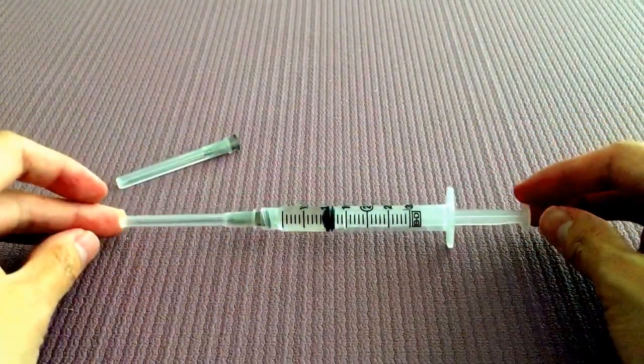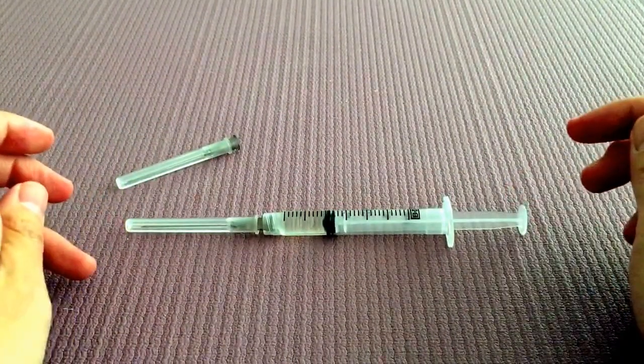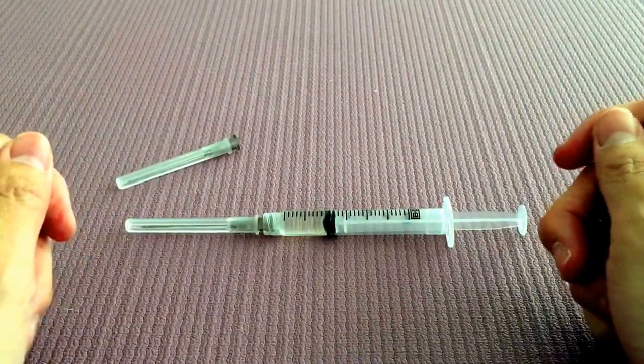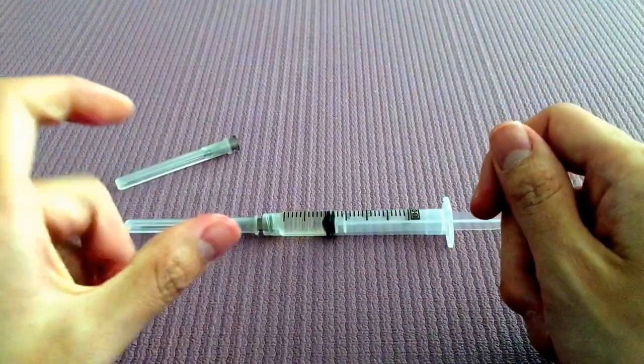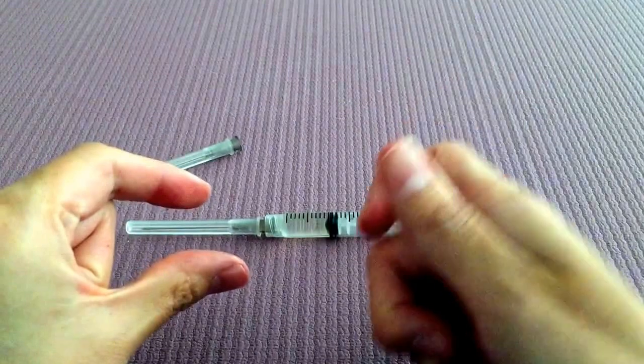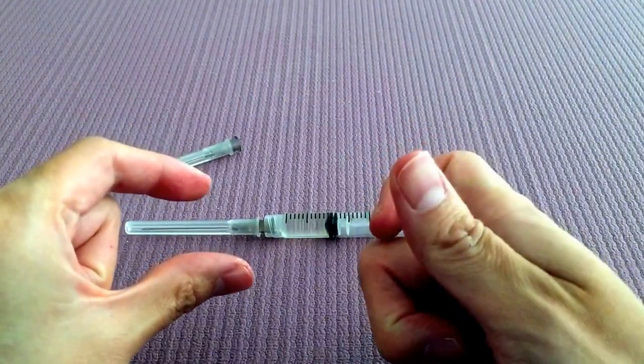So some tips for the injection itself. You want to pick the upper outer quadrant of your buttocks. You want to pinch it real hard. And then just go in straight and fast. And then inject the medication.